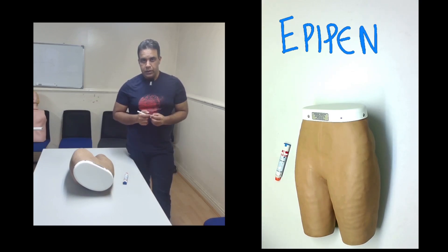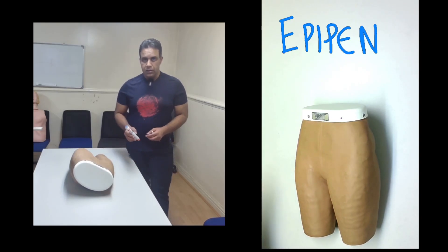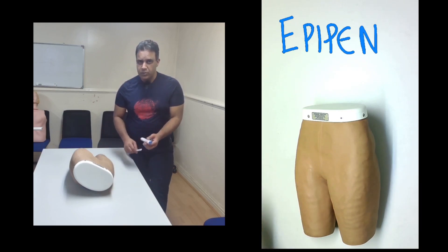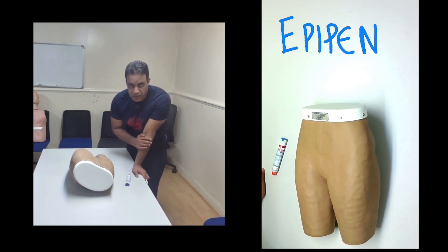Today I want to teach you EpiPen — how to use it and how you can teach it if you need to in your exam. EpiPen is a single-use drug delivery device. It contains adrenaline and it is used to prevent anaphylaxis. This is very important for someone who is known to have anaphylaxis; they should keep it with them at all times.